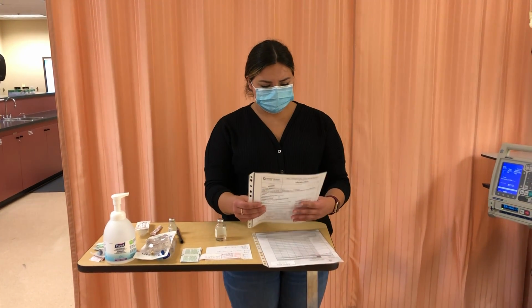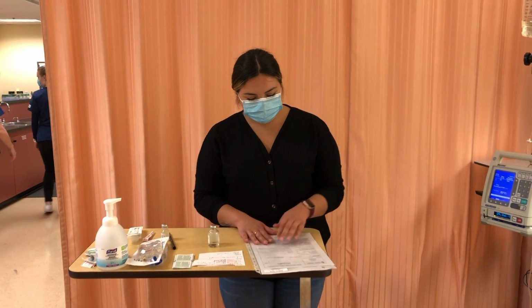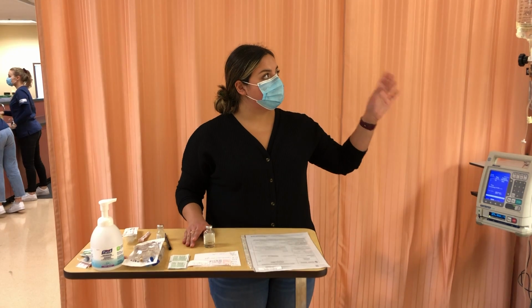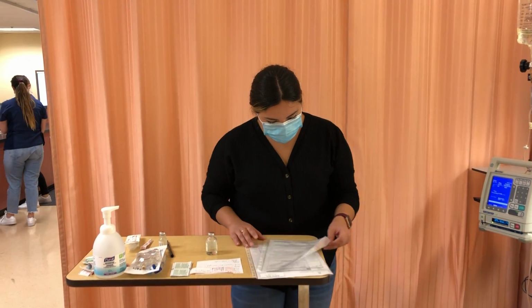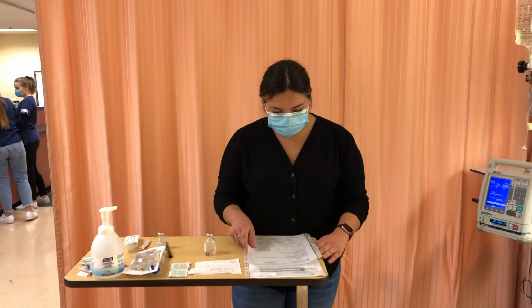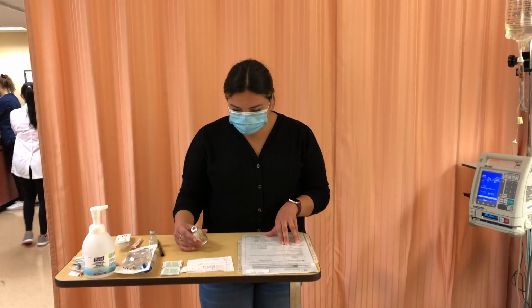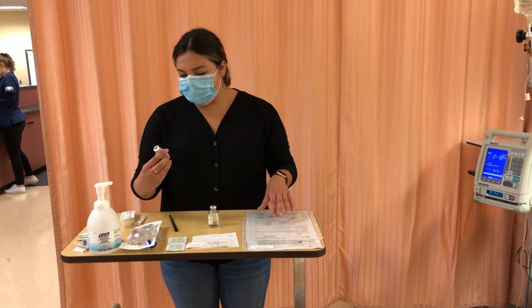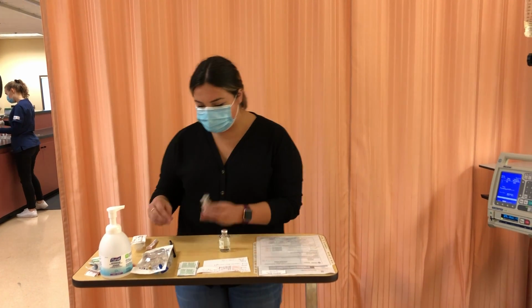I'm just going to assess my compatibility. So this drug is compatible with normal saline and D5W. My secondary bag is normal saline, my primary bag is normal saline, so both are okay. So I'm okay to keep prepping this med. So as per PDM, I'm reconstituting a 2 gram vial with 6.8 milliliters of sterile water for injection. I've ensured that this is not expired.